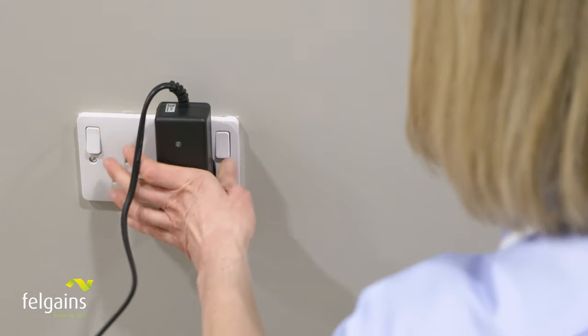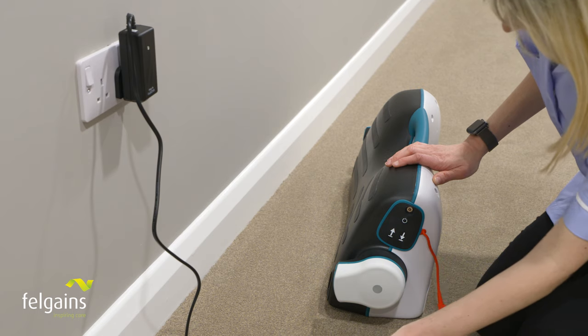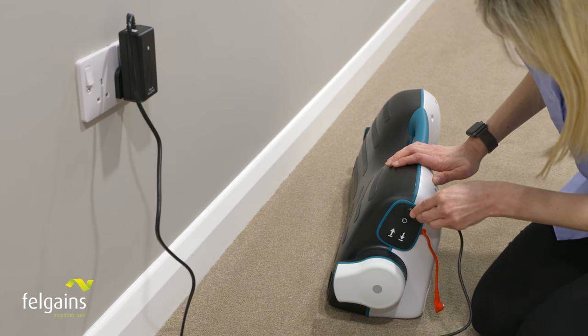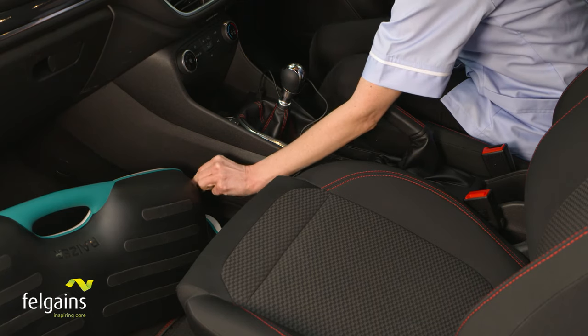If you're a paramedic or falls responder, you'll welcome the fact that the Razer 2's high-capacity batteries retain their charge so well they'll last several shifts. And the in-car charger means you'll never be waiting on batteries either.